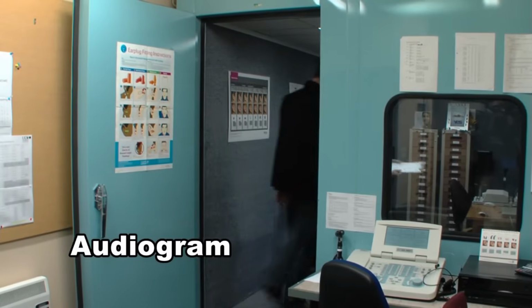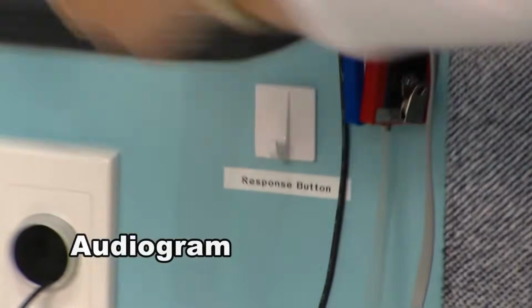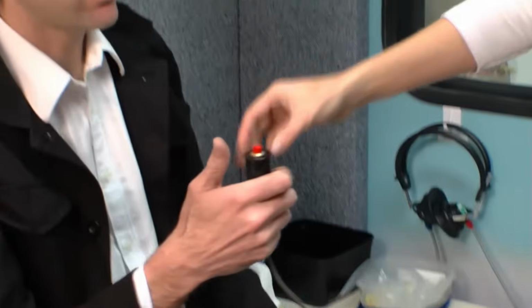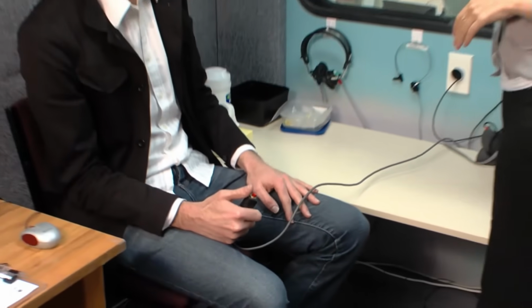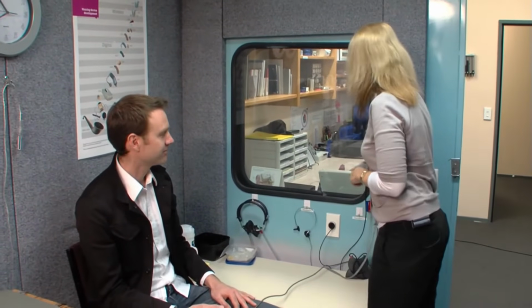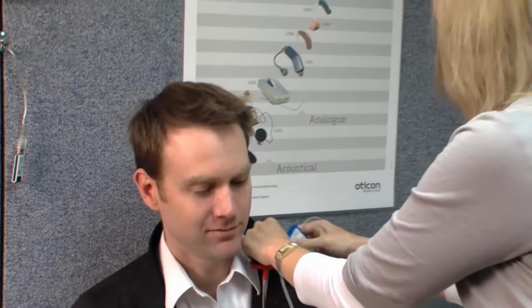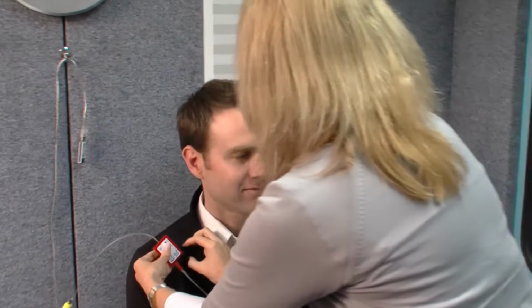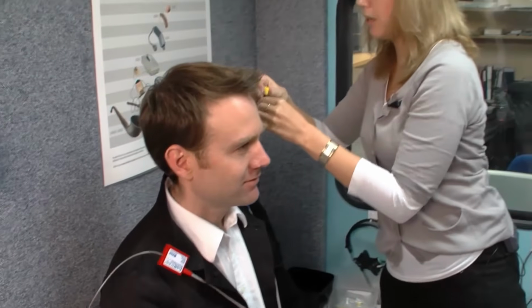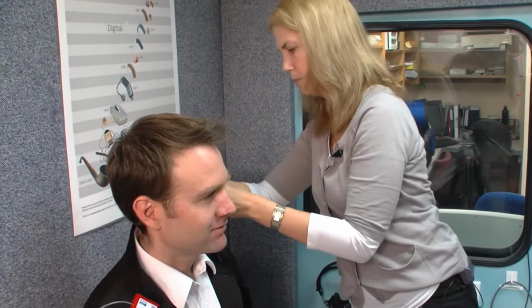Here we go, just have a seat there. So I'll just give you that button there. Great. So what's going to happen is I'm going to put some headphones in your ears and you'll hear beeps in one ear at a time. So whenever you hear a beep, you're just going to press that red button, even if it's very soft. Okay? I'm just going to put these in your ears. These are clipped onto your jacket? Yeah, sure. Okay, so it just sort of goes in your ear like a foam earplug.